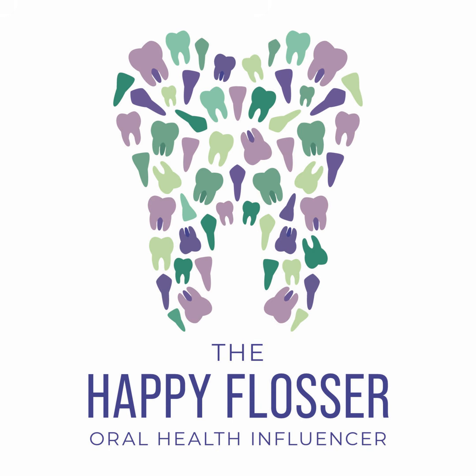So now you're looking at the screen and you're seeing this image and you're seeing all kinds of different gray scales. You're seeing lights, you're seeing darks, you're seeing blacks, you're seeing whites, all on this one radiographic image. All of those things are indicative of the density of the items that you are trying to take an image of.